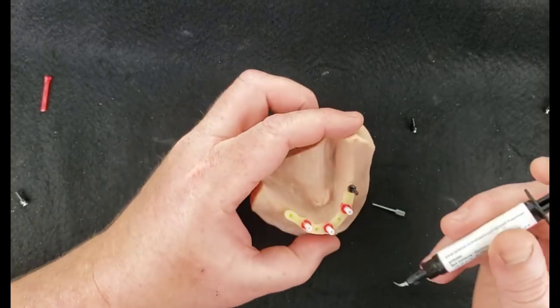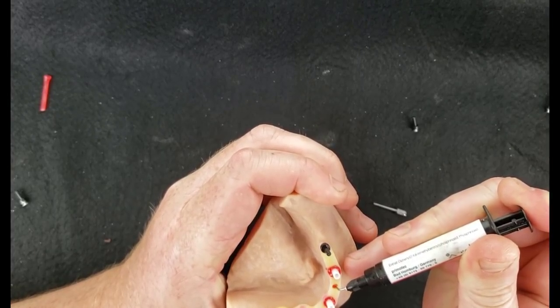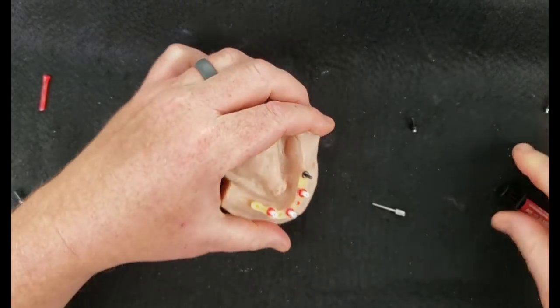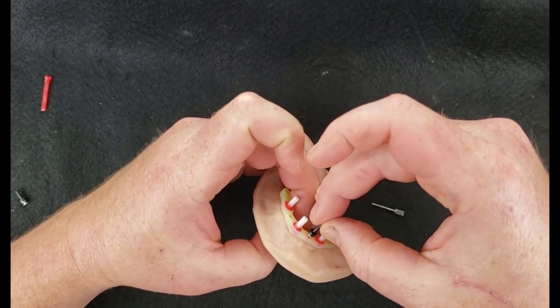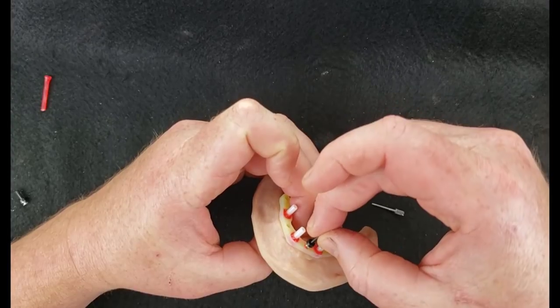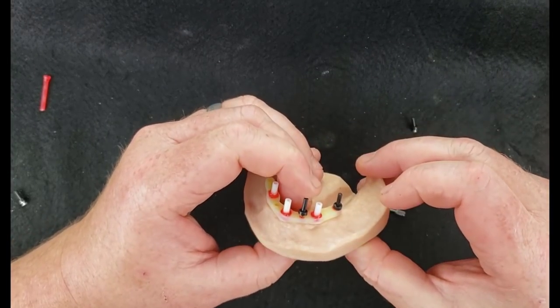Alright, that's one. Take our next one, press in to the hole. There we go.